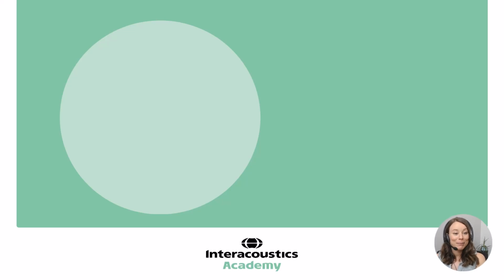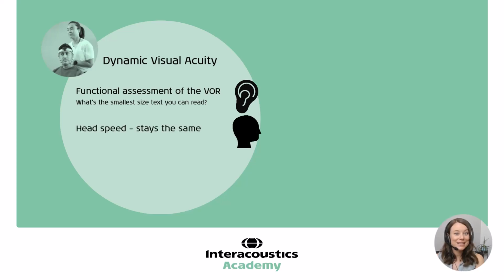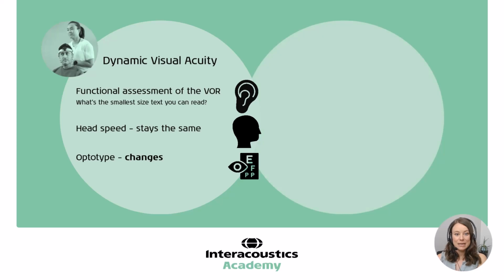First, we're going to talk about dynamic visual acuity. This is a test that looks at what we call the functional assessment of the VOR. The question we're trying to answer is, what is the smallest text size that you can read? When performing this test, the patient is moving their head at the exact same head speed, and the optotype is flashing on the screen and changing in size. As they get the answer right, the size gets smaller, so it gets a little bit harder. As they get the optotype direction wrong, that optotype gets larger. So that's the purpose of the test. We're just trying to figure out their dynamic visual acuity, the smallest size that they can see clearly.